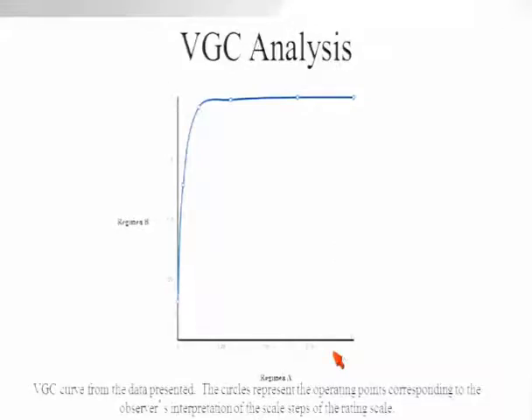Then we looked at the visual grading characteristic. This type of test on image quality looks at the quality of the wall of the ascending aorta. So for a radiologist to have a look at the wall of the aorta to correctly diagnose an aortic dissection or a PAU or a hematoma or intramural hematoma, we looked at the quality of the wall. And what we found was with higher levels of opacification and increased reduction levels of venous opacification, the radiologist was more confident in giving their diagnosis.